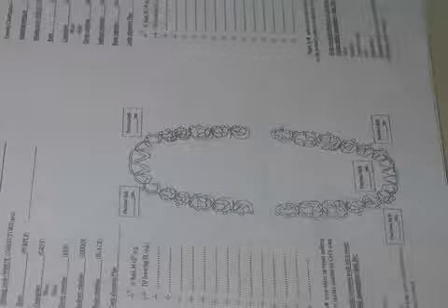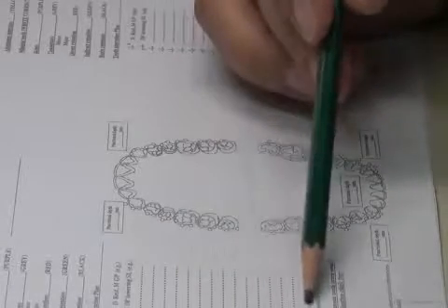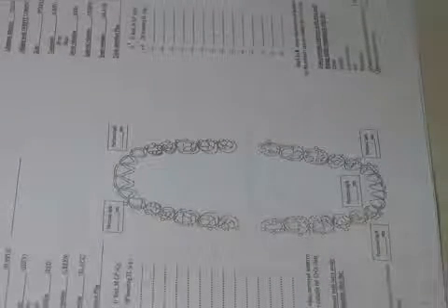Sometimes you think you can overcome a lingual tori, for example. You have a bony undercut, and you think by your design you're going to overcome it, but once you finish your design, you find that there is no way that I could overcome this undercut. The only option left is surgery. So I need to write down that for this patient, I don't do my final design unless I do a surgery for this, okay?